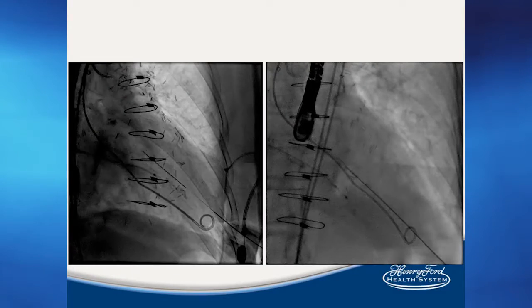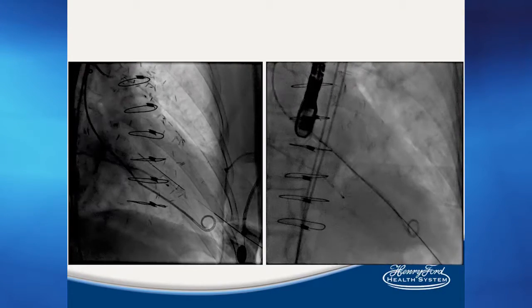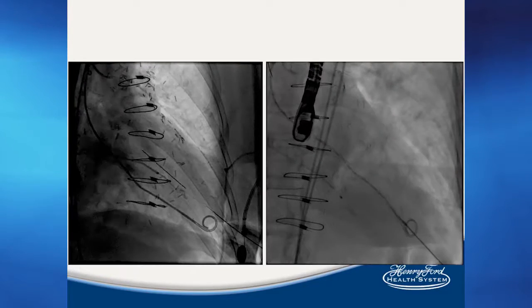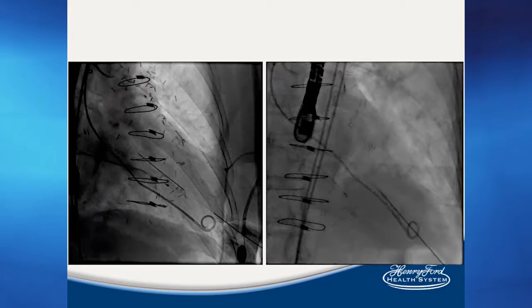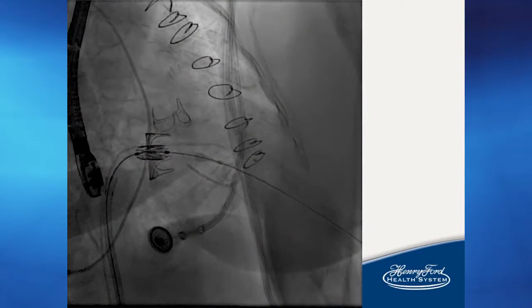We did a coronary angiogram just to make sure we were safe. And this is what it looks like. And you can see it's just a small tube that's in the chest. And we use this access to help us deliver a valve in case we have a hard time lining it up. And so it looks like this.